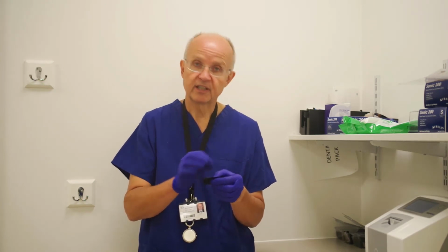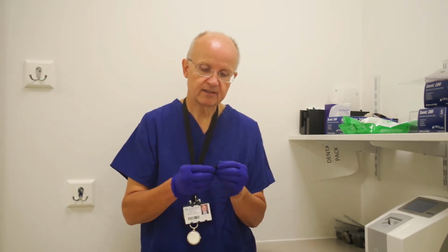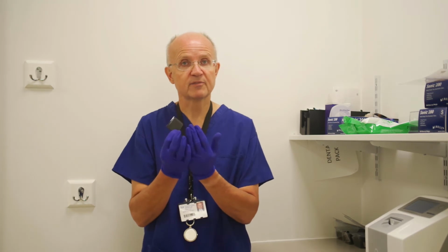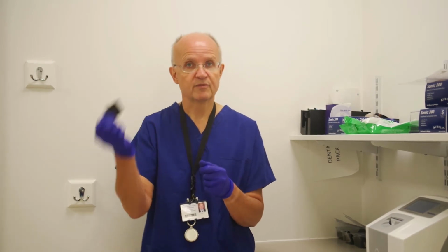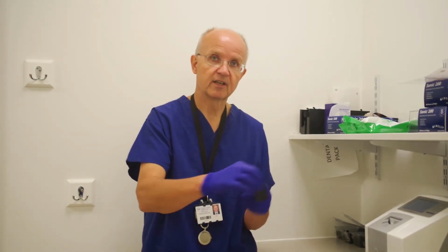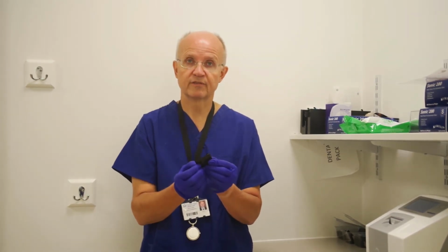So once you've popped it in, you seal that up and that's nicely kept in there. It'll protect it from saliva, from physical damage and scratches, and it also protects it from light. And we'll show you, once we've taken the X-ray, how we process that without light reaching the film.